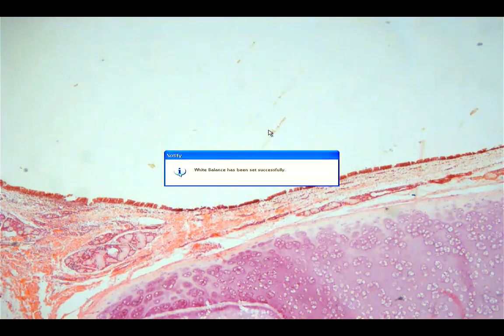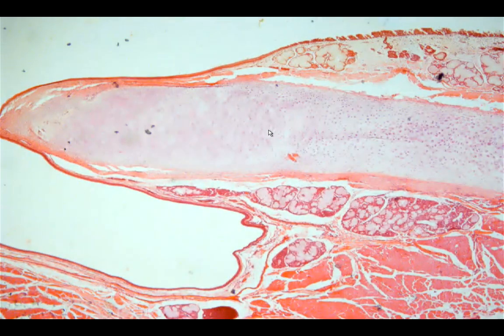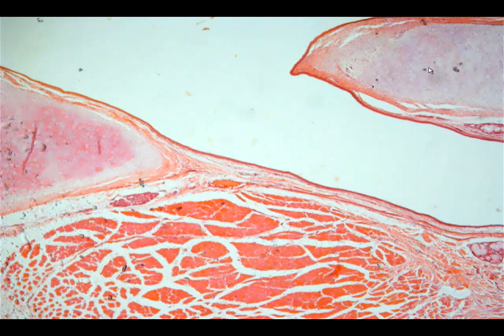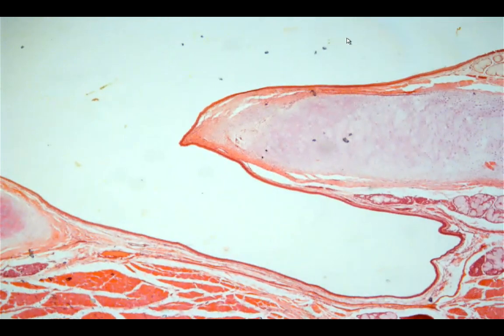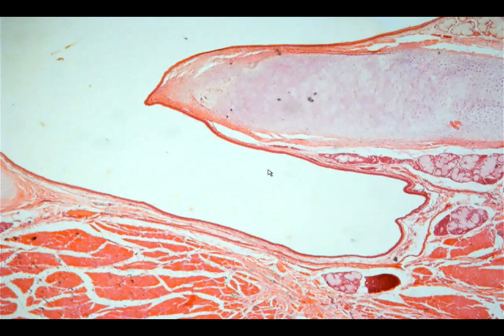Next we go to the larynx, which is our voice box. The larynx contains the glottis, which is composed of two vocal folds. This is the true vocal fold or vocal cord. The other fold is called the false vocal cord or ventricular fold. The recess or space in between them is called the ventricle.